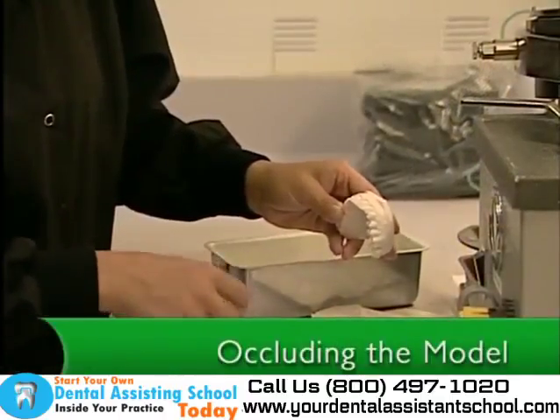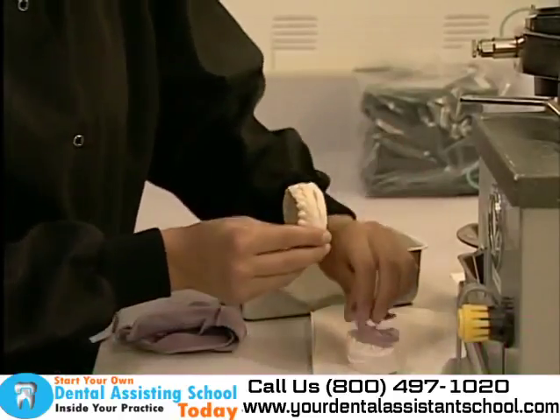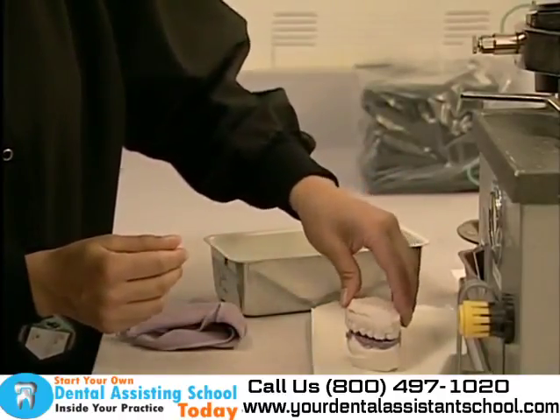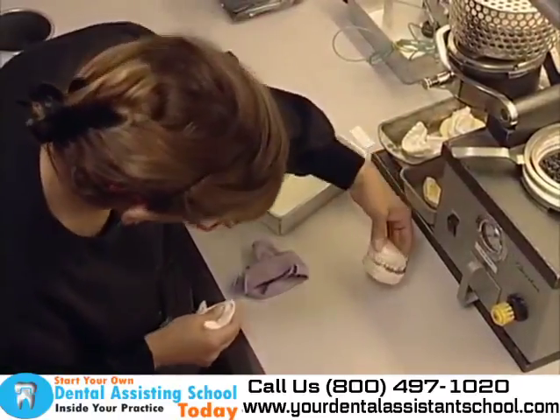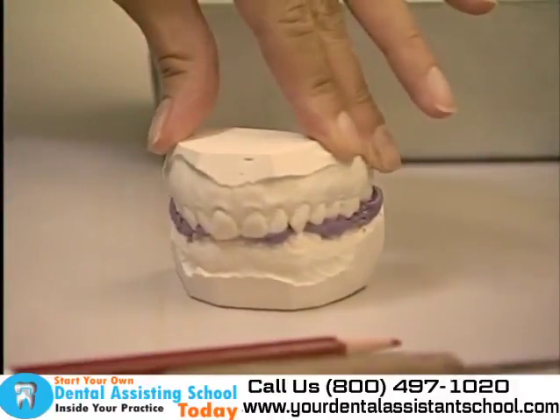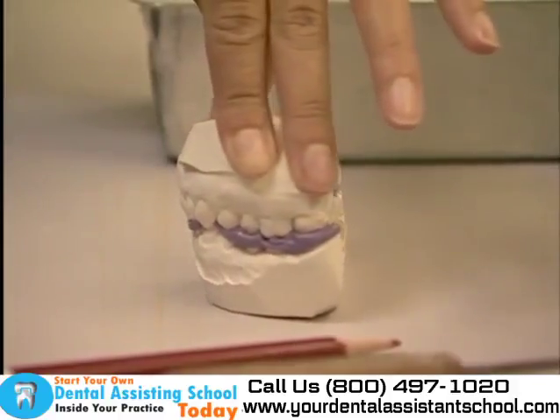After the model is carefully trimmed, it is smoothed and polished. The dental assistant should place the upper and lower models together in bite position on a flat surface and line up with the wax or silicone bite. The occlusion of the model should exactly match that of the bite impression. An exact match ensures the study model correctly matches the patient's occlusion.